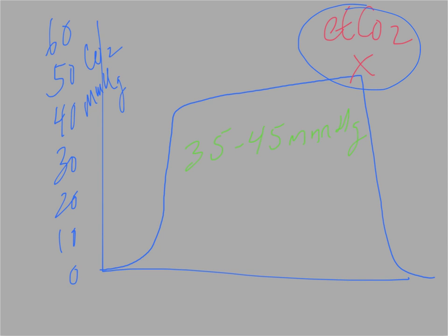Now, since we're going to be discussing waveforms today and waveform recognition, this slide is also good to remember what our waveform should look like. And though this is my drawing, this is relatively similar to what a waveform should look like. And if we remember our analysis, this is our exhalation with our first initial washout of dead space air with carbon dioxide coming from the lower part of the lungs and the middle part of the lungs and such.